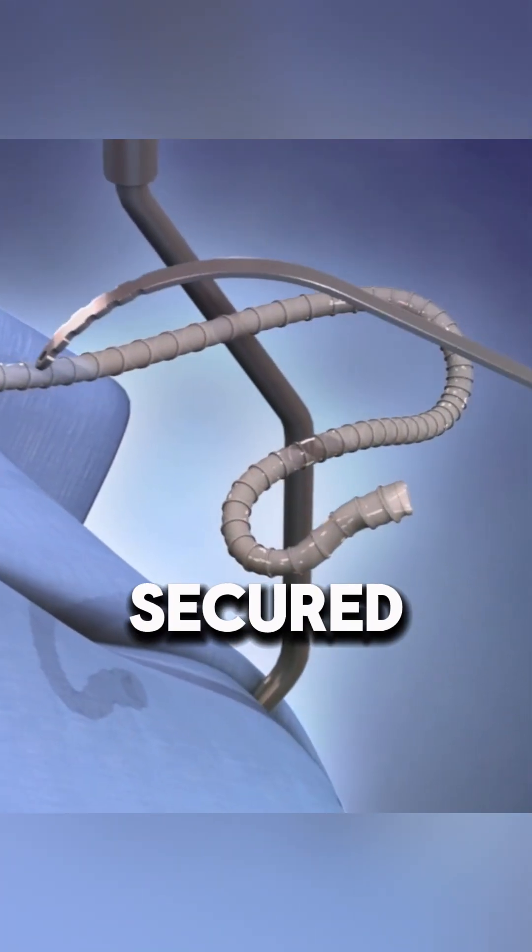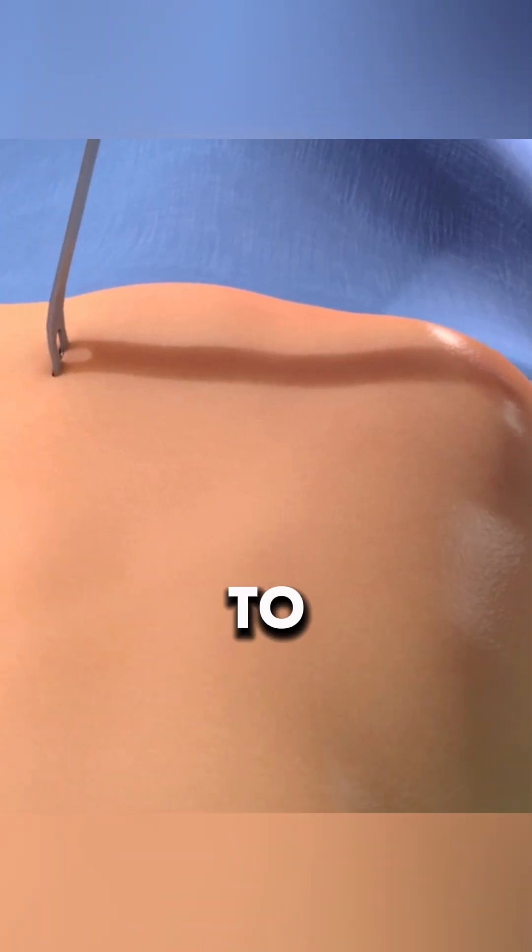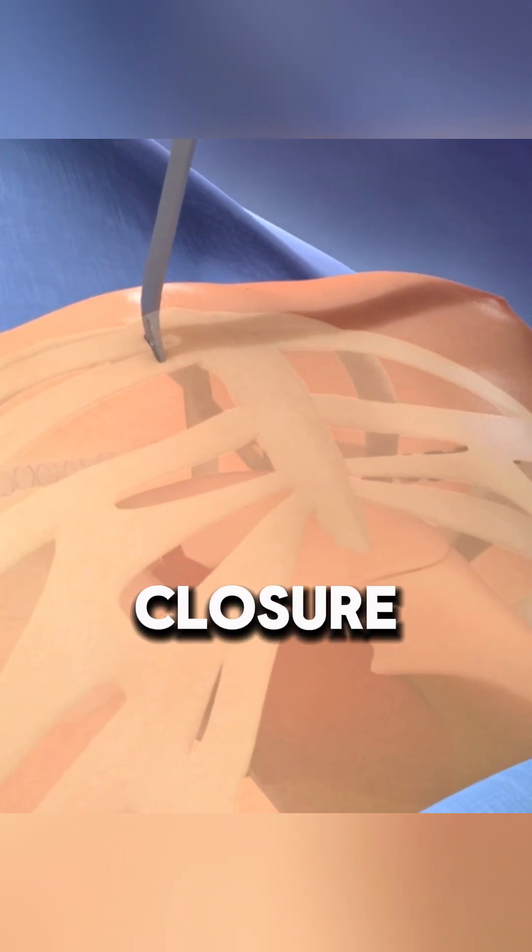It is then secured with heavy sutures and sometimes stabilizers to hold it in place.